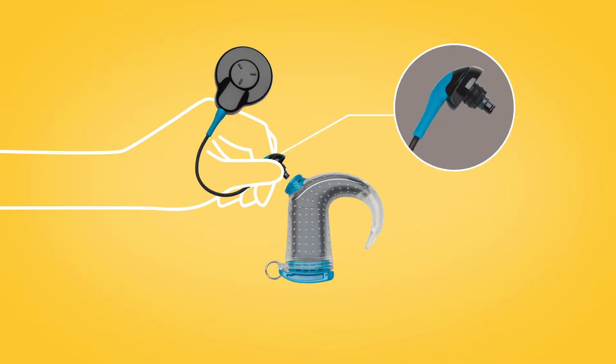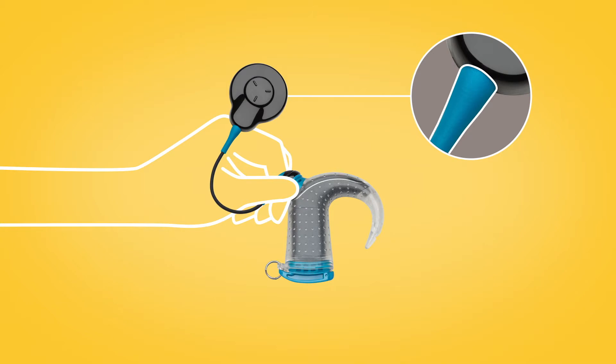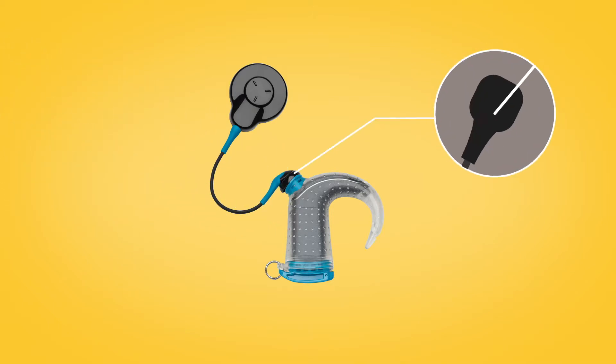Gripping the black ring on the coil connector, plug the blue Aqua Plus coil with magnet straight into your sound processor through the hole in Aqua Plus, being careful not to twist. The coil plug should feel securely connected.